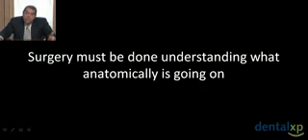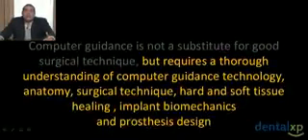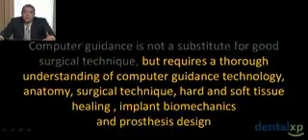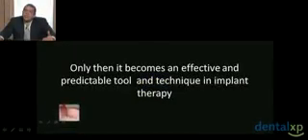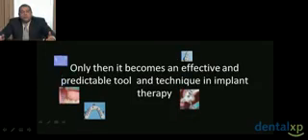But even with all this, surgically, we have to understand what anatomically is going on. We can't do this completely blindly. Computer guidance is not a substitute for good surgical technique, but it requires a thorough understanding of computer guidance technology, anatomy, surgical technique, hard and soft tissue healing, implant biomechanics, and prosthesis design. And only then does it become an effective and predictable tool and technique in implant therapy.